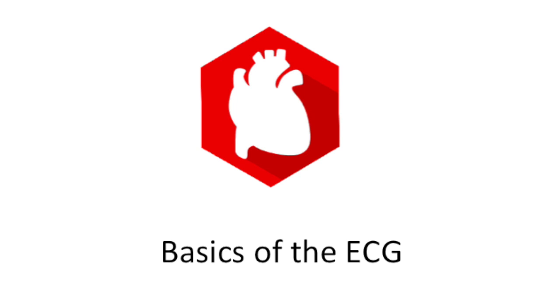Now, this video is a follow-up from the episode that I did quite a while ago now. In the making of this video, I had to think to myself about what makes a very good ECG video, having seen a few of them myself, and I set out thinking that maybe I could try and make that one video which I could title the one ECG video that you'd ever need. Just isn't very possible.